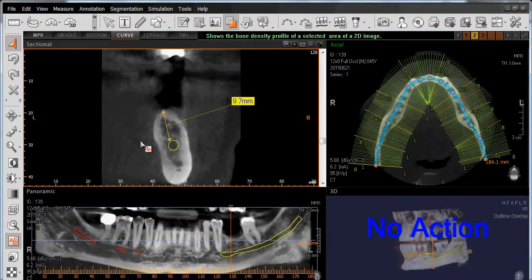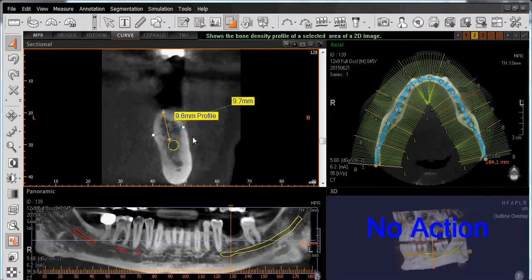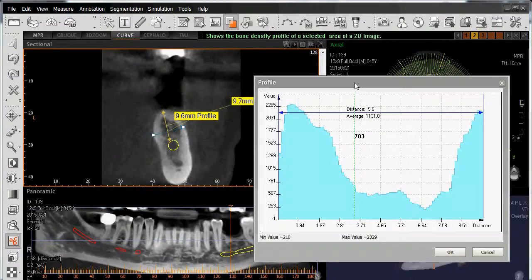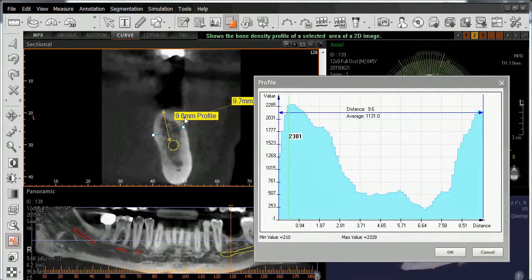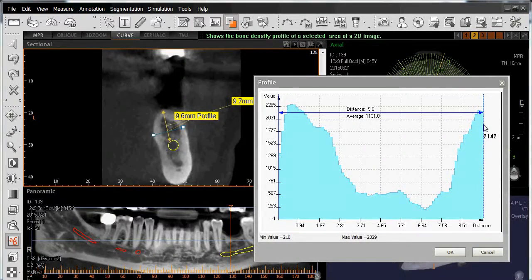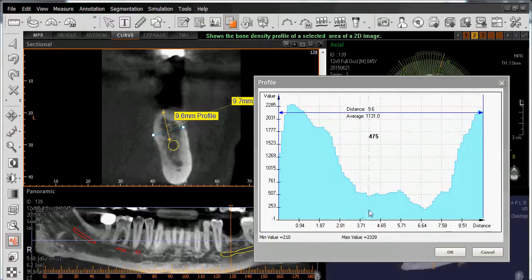From here, we'll do a measurement again going from the cortical plate to cortical plate. When we do that, a window will appear giving us the assessment of bone quality between these two points. We have our distance — in this case 9.6 millimeters — identified between these two points, and then our profile giving us an assessment of bone quality between them.